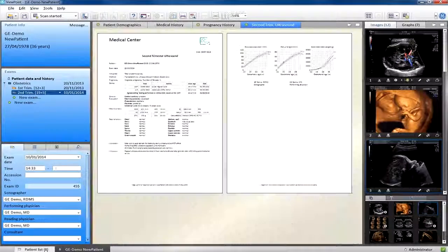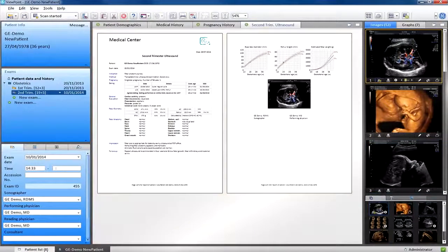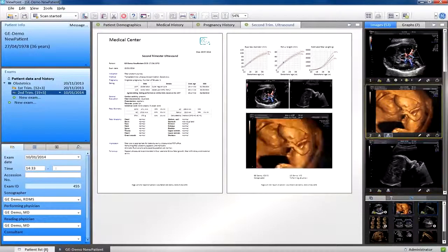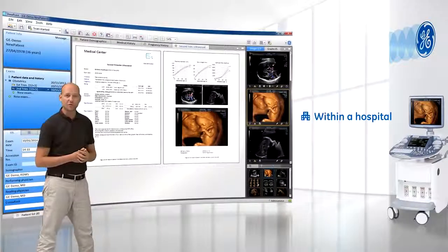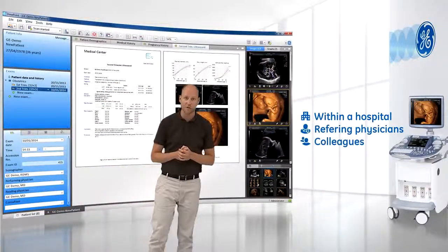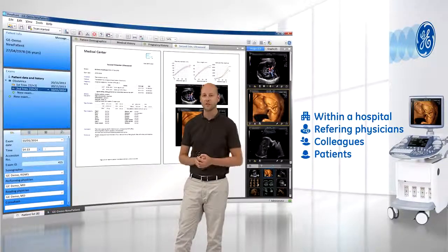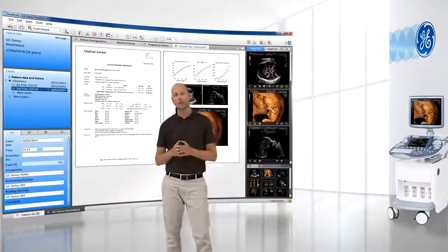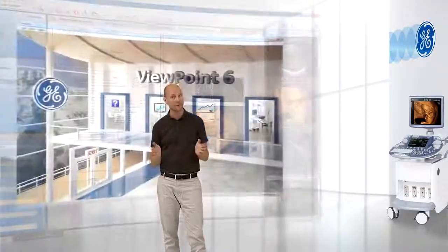With one click, I can preview my report. And as you can see, charts are pre-selected and I can easily add key images. Viewpoint now allows me to share this report within a hospital or clinic with referring physicians, with colleagues for additional review, as well as with patients. And instead of potentially long turnaround times, Viewpoint gives you the possibility to share examination results immediately with anybody.